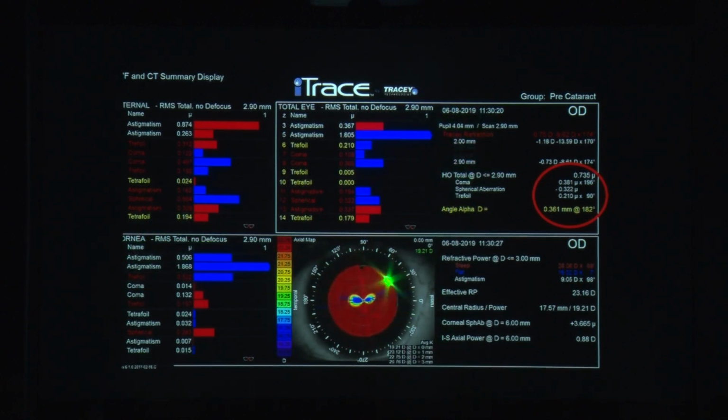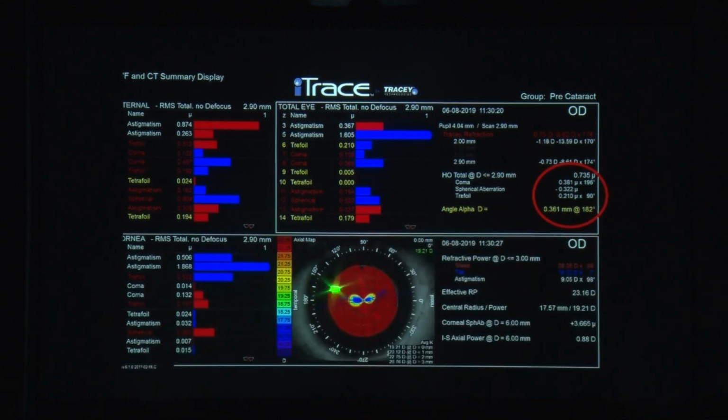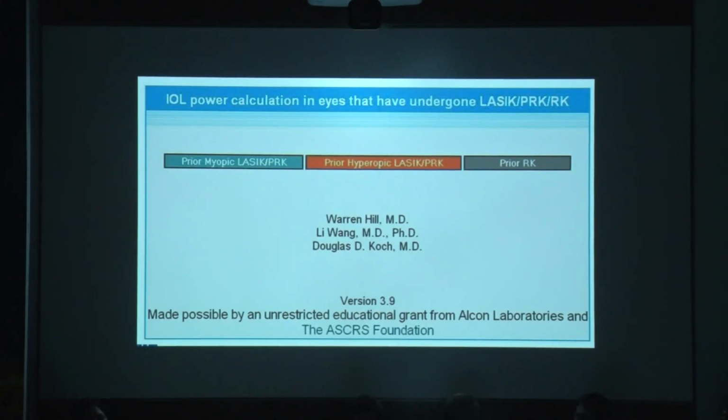This also has a Placido disc topography, and again coming to the point that in these eyes, these are the eyes when you want more than one type of technology. In a regular patient, it's okay if you just have one or max 2. But here we confirmed it with the eye trace or the aberrometry. And we found that the total higher order aberrations were not that high. And we went to the ASCRS post-refractive calculator, which still is our go-to and again freely available.